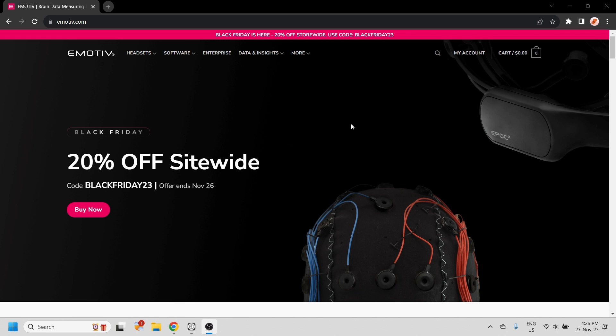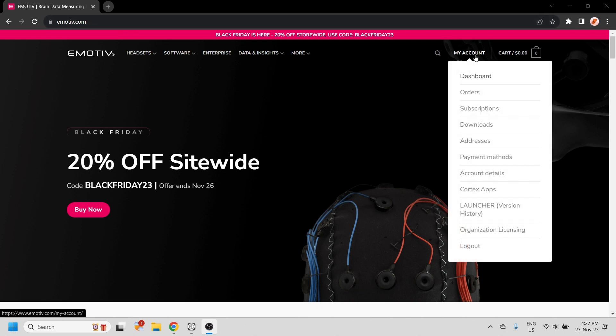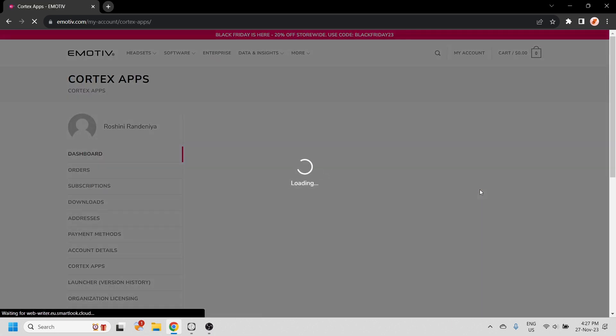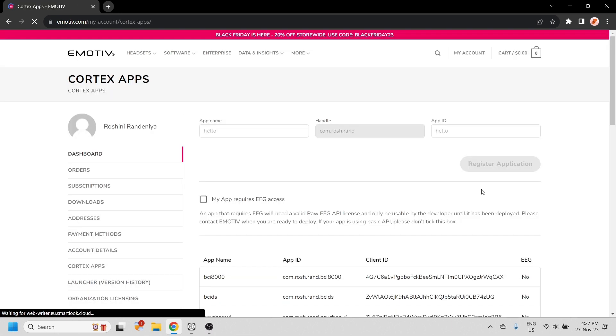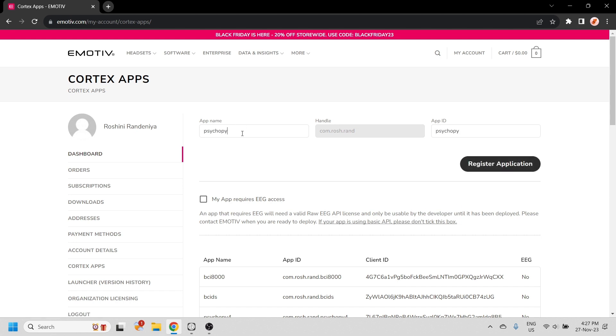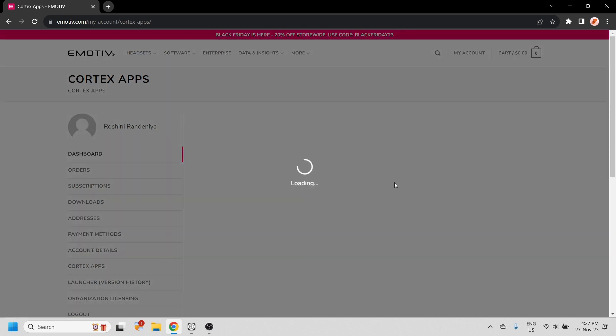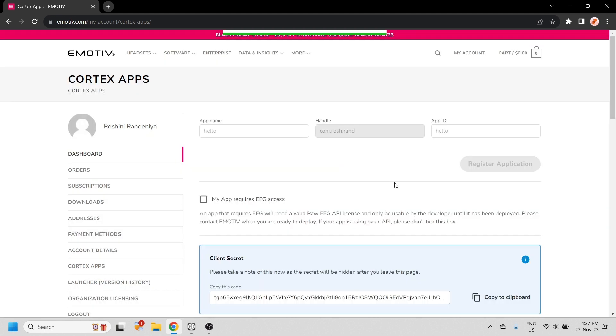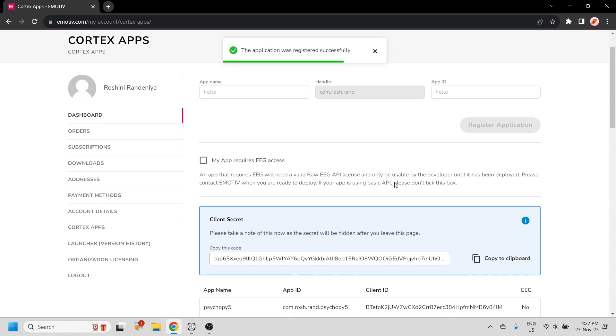Before we can connect to PsychoPy, we need to create an app ID. Go to the Emotive website and under my account, select Cortex apps. Here you can give your app any name and register it. You'll receive a client ID and a client secret.